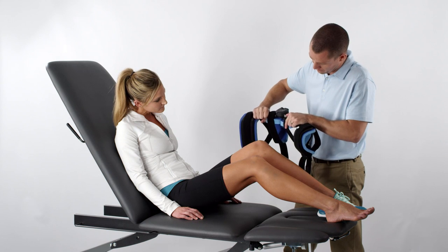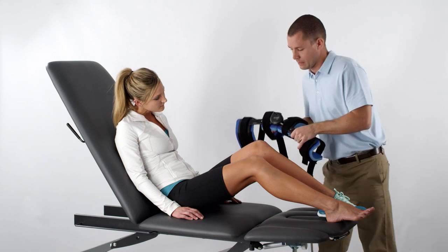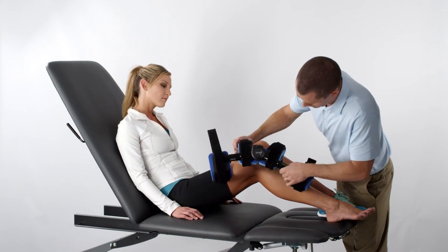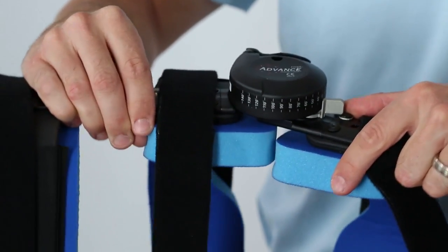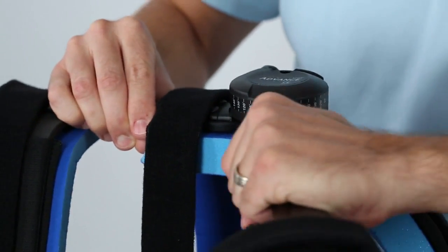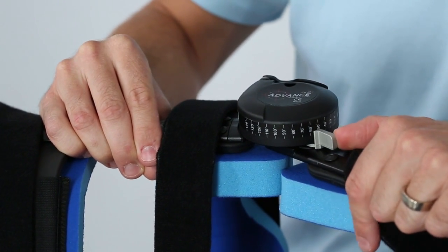Next, lock the device in place at approximately 45 degrees, or as close to 45 degrees as the patient can comfortably tolerate. The locking mechanism on the advanced orthosis is designed for easy application and removal of the device, and can be engaged in 5-degree increments throughout the patient's range of motion.